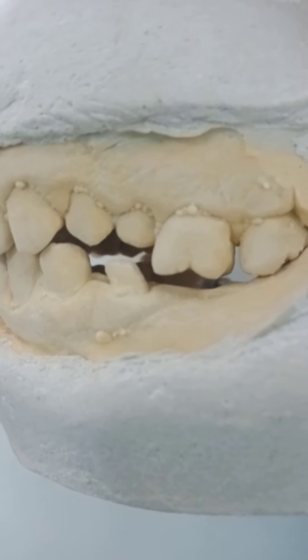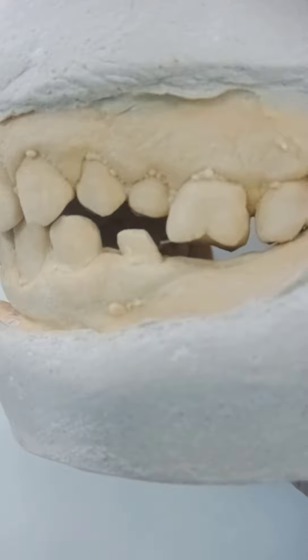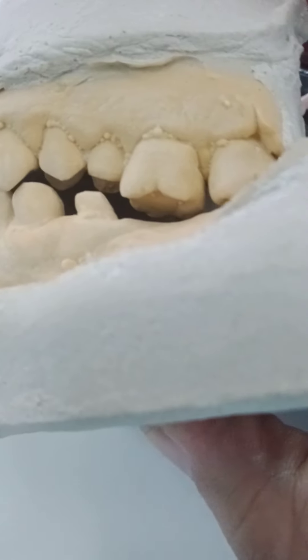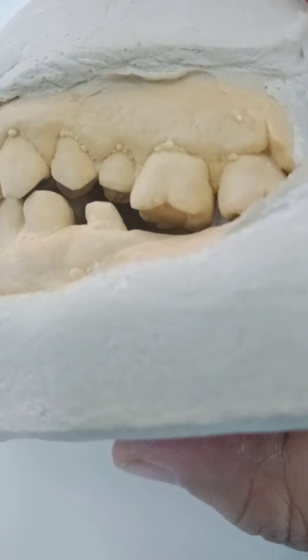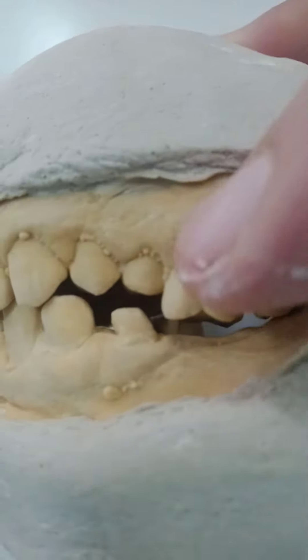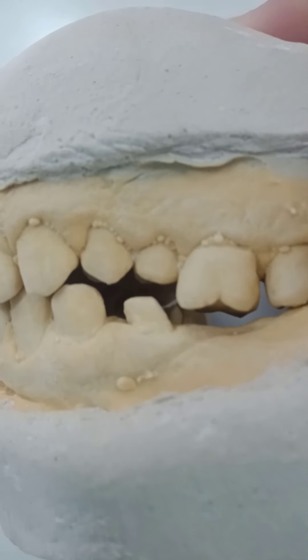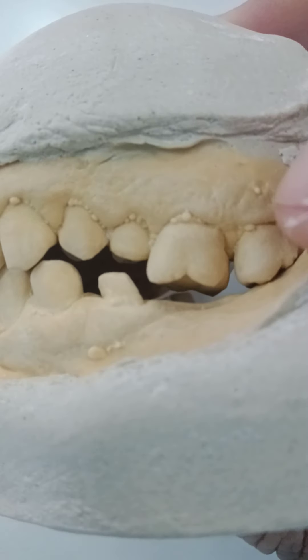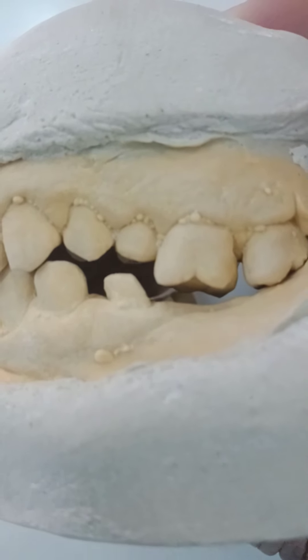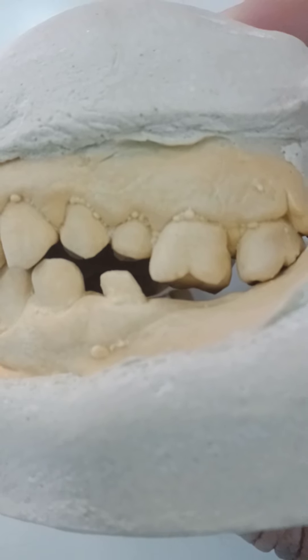How long has this been edentulous? Years — a very long time. The patient has grade 2 mobility here, and also grade 2 on this one as well.